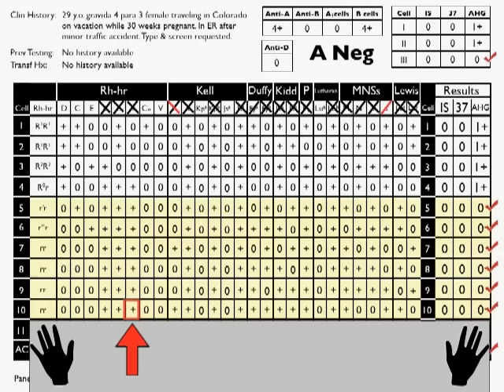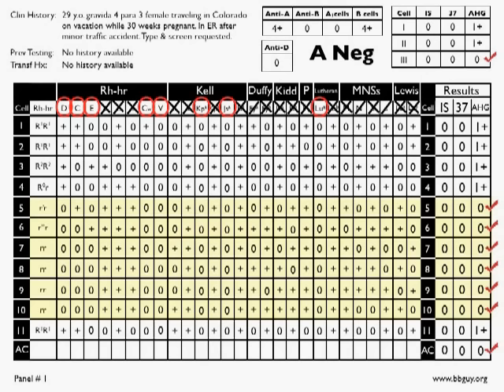Okay, I hope you're with me. So at the moment, your panel should look very similar to mine. What you want to do next is go through and circle all the ones that we have not been able to rule out, which, as you see, include big D, big C, big E, CW, V, KPA, JSA, and Lutheran A. Everything else has at least one double dose or homozygous rule out. Okay, I mentioned in the previous podcast that I do this a little bit of a different way.